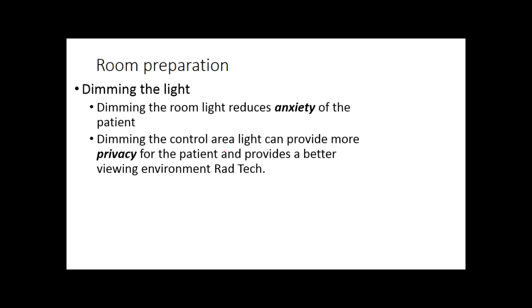The other reason is that dimming the light also provides privacy for the patient. They feel more comfortable if the light is dimmed. There are less details of their body, whether they are wearing a gown or their normal clothes, if they are lying down. It also provides a better viewing environment for the rad-tech, especially if they are viewing the monitors.